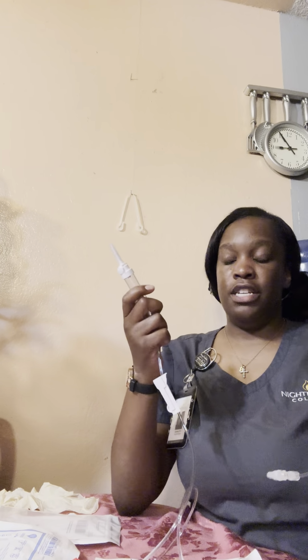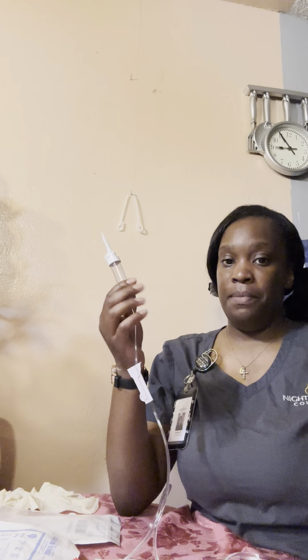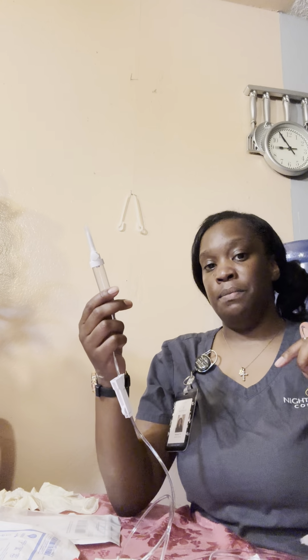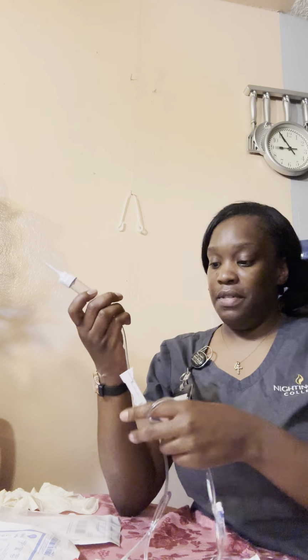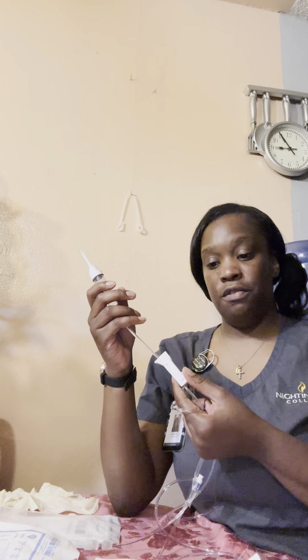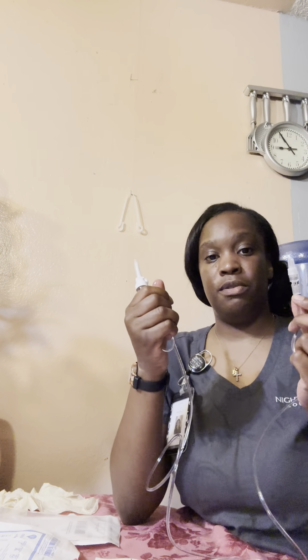Then we have the drip chamber. This helps with regulating the air, and it also gives us a visual of our flow rate. This is our roller clamp. This helps us to control the flow rate. When it's in the down position, it is closed. When you roll it up, it is open. Here is the Y site. This is where the medication will be inserted into. And then we also have the adapter end, and this is where it goes into the patient's peripheral IV site.